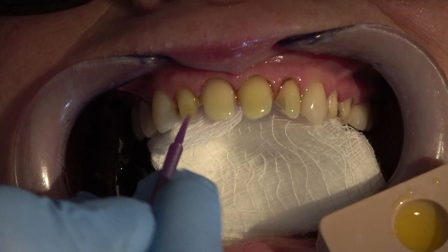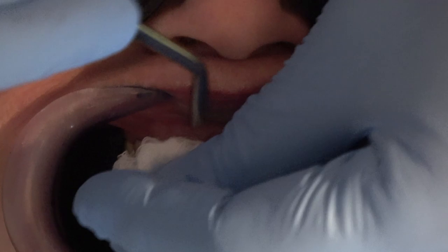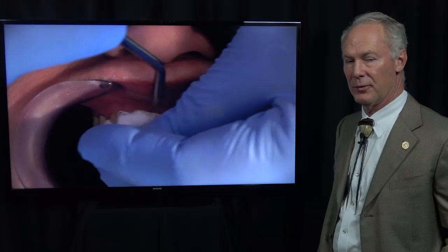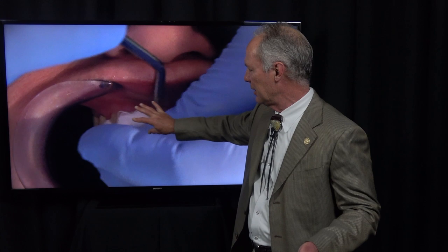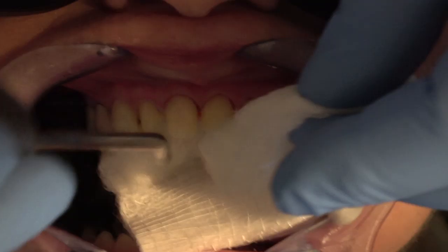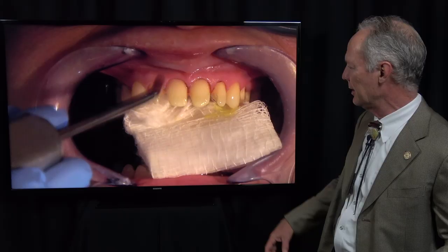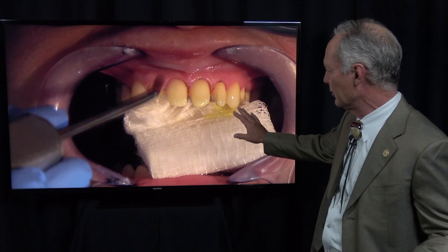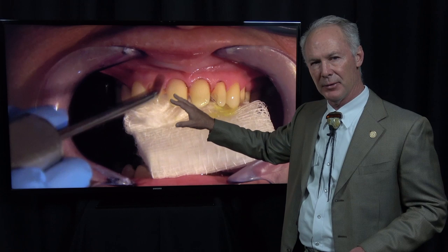We're placing that. Now pay particular attention to this part where the composite has come out. It's life in a real practice. That happens. All right, so I'm going to blow the primer adhesive off onto this 2x2. Put another 2x2 up on the teeth so you don't get it all over the adjacent teeth and the gum tissue, and blow it onto that 2x2. Blow anything wiggly off. You don't want anything wiggling on the tooth because you want to get rid of the carrier for the primer, which is acetone or alcohol. If you don't blow it off, that acetone and alcohol stays in the primer and it can weaken the bond strength. So blow any excess off.